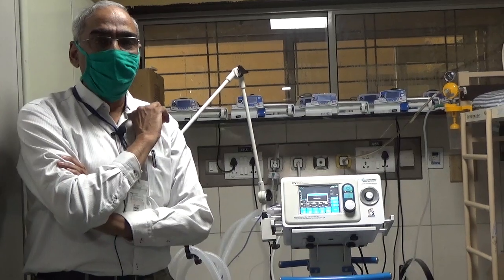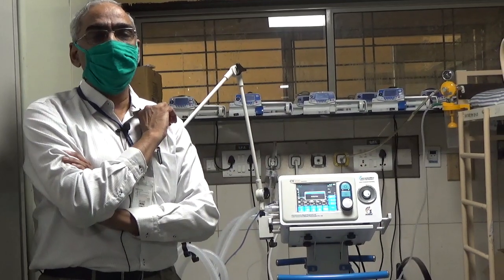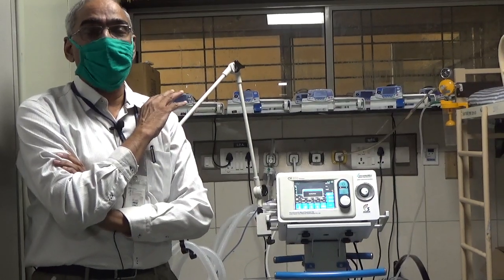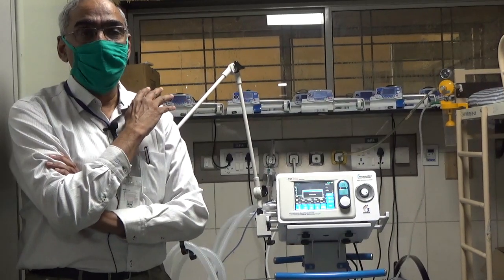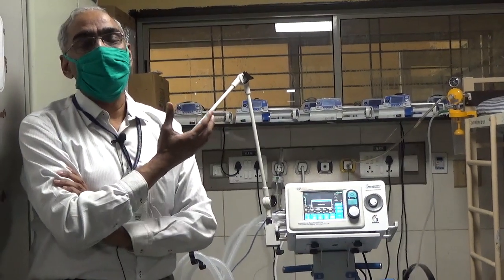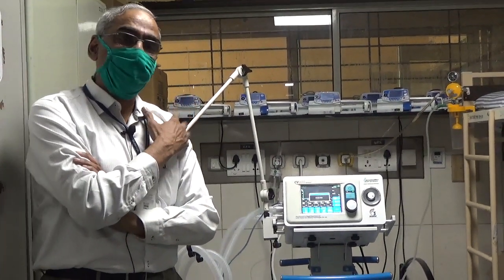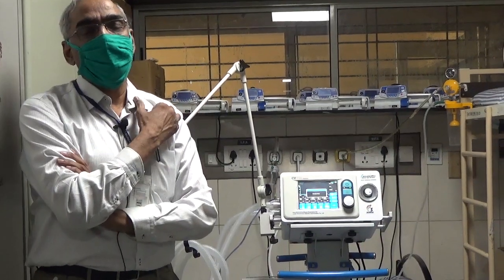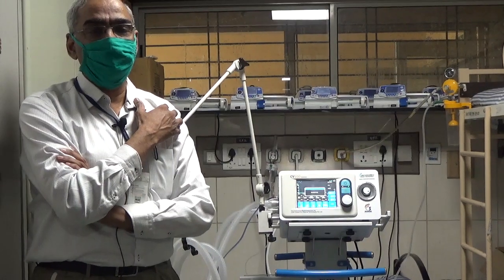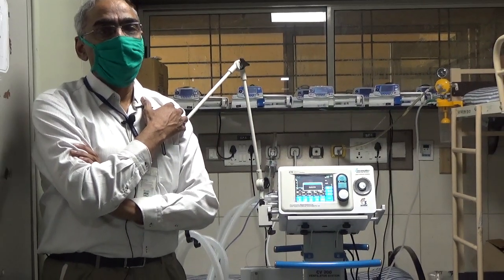Please remember, in the setting of COVID-19, non-invasive ventilation can produce aerosols and should be used only sparingly. In case you need to use it, it should be used as a bridge to invasive therapy. Preferably, you would be using HFNC or invasive ventilation. But of course, in selected circumstances, non-invasive ventilation has a role to play.